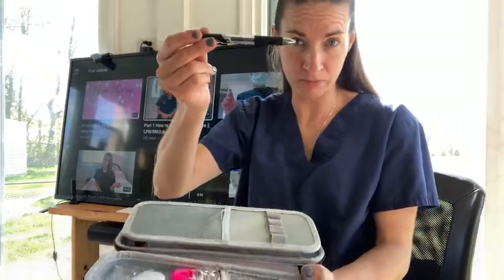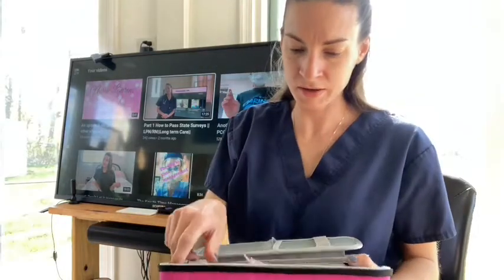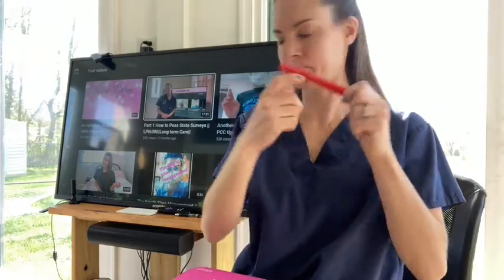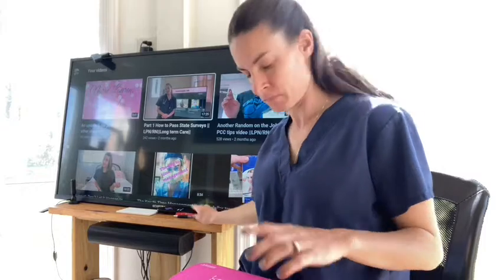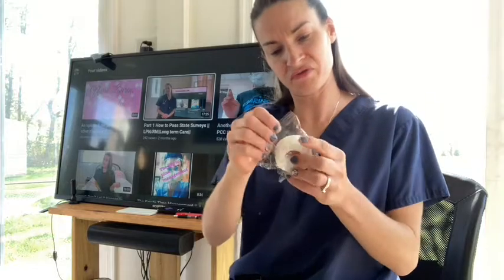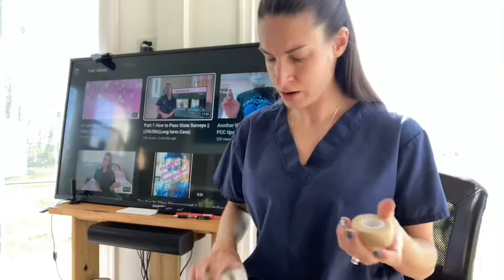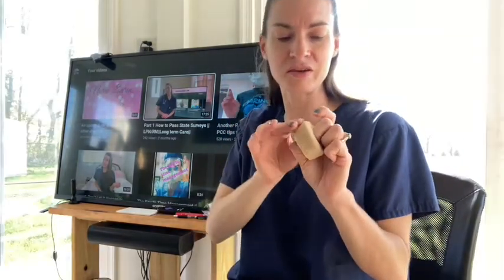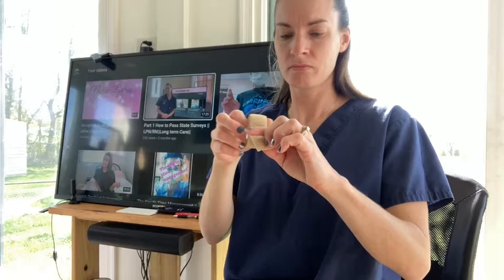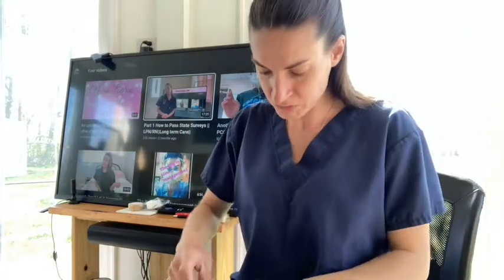It did come with a pen — I'll put that in my bag with my pens and highlighters. It also came with a permanent marker. Then it comes with these bandages — self-adhesive and flexible, so you can see how it's not coming apart and you don't really need tape. It's clean, and it comes with four of them.